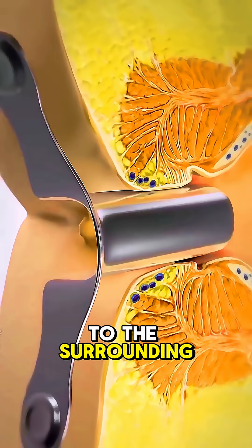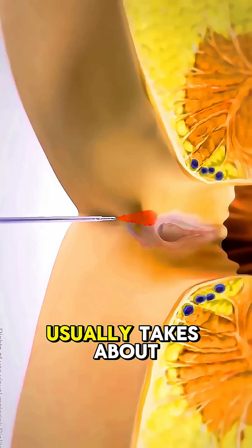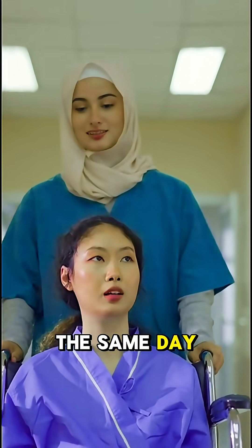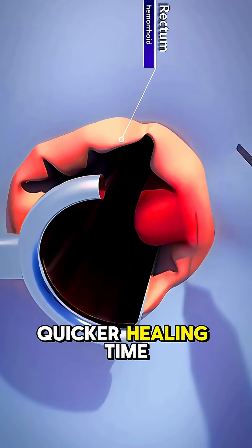There's minimal damage to the surrounding tissues, which means reduced postoperative discomfort. The entire procedure usually takes about 20 to 30 minutes, and most patients can go home the same day. Compared to conventional surgery, laser hemorrhoidectomy has a lower risk of infection and quicker healing time.